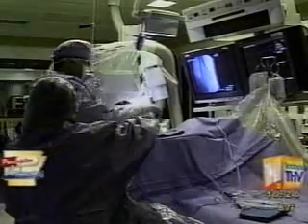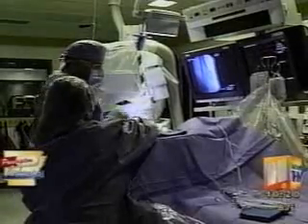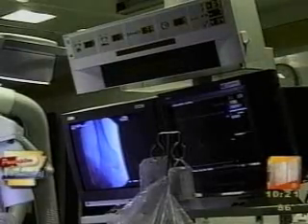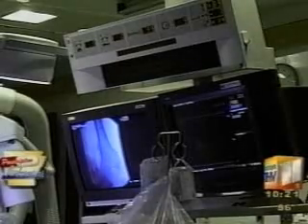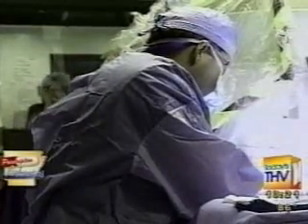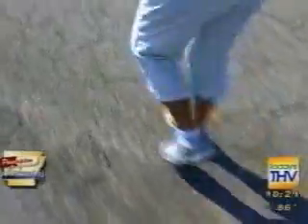There's also a mini Silverhawk to reach the tiny arteries on the surface of the foot. Those cases are used when trying to save a toe or a foot that may have an ulcer, possibly gangrene, or for diabetic patients who really had no other option but amputation.